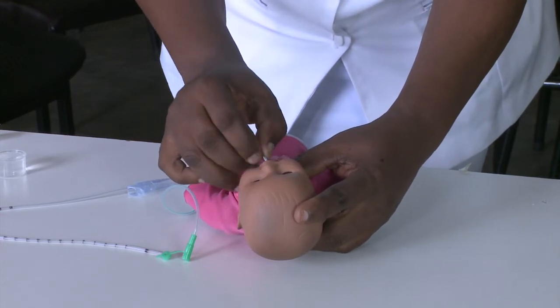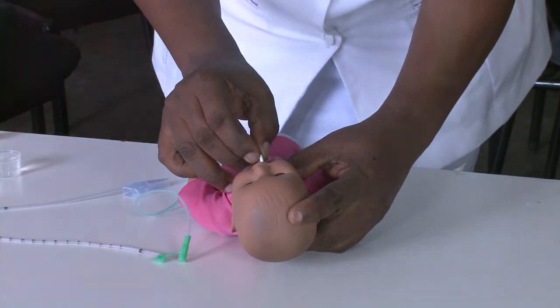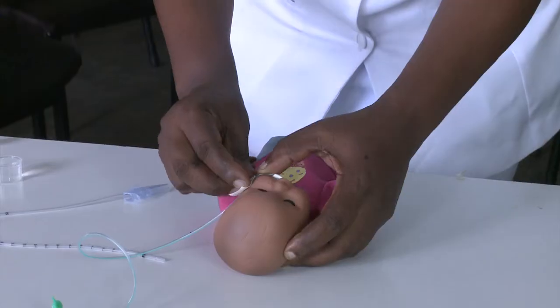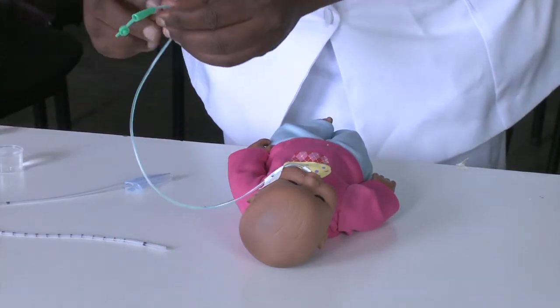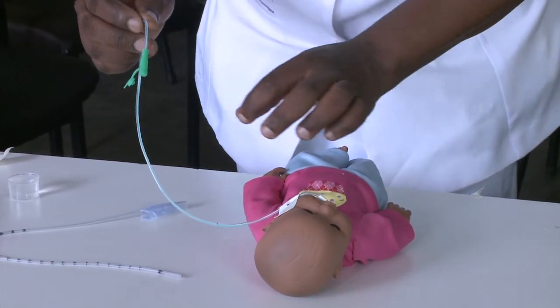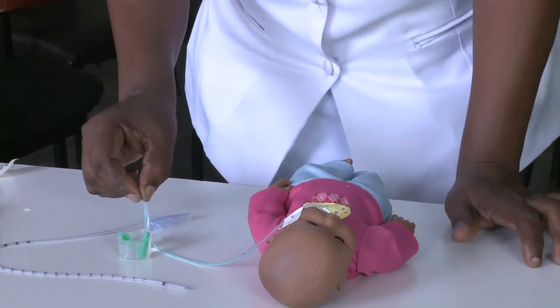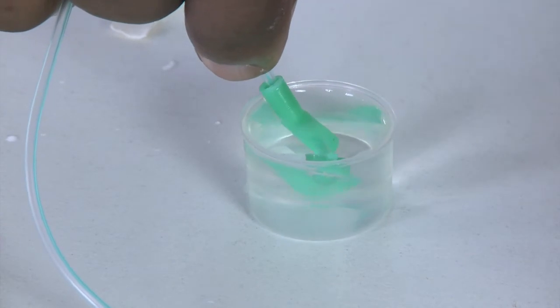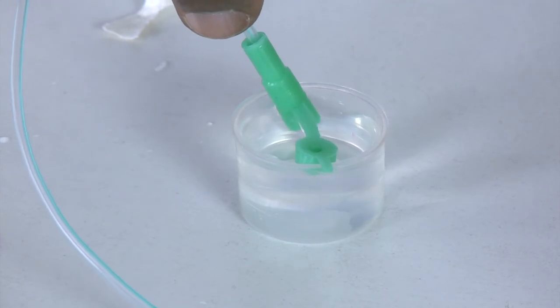I will insert the tube in the mouth because the nose will be occupied with the prongs. I will insert it up to the length that I marked. Then I'll put a tape to hold the OGT in place. I'll make sure to test if the tube is in the stomach. I've got my water for testing — if there is no bubbling in the water, that means my tube is in the stomach. If there are bubbles in the water, it means the tube is not in the right position.